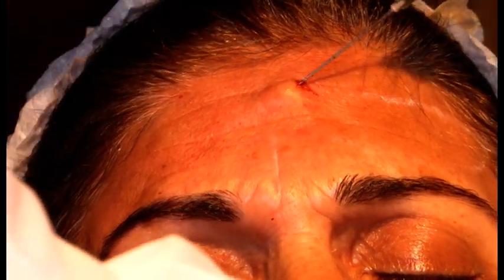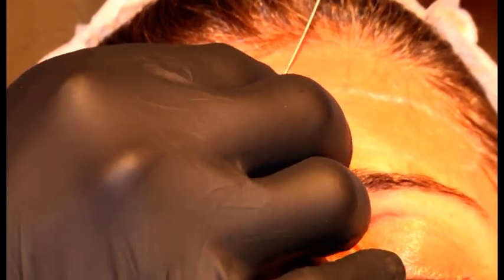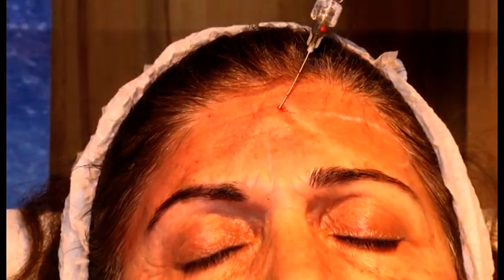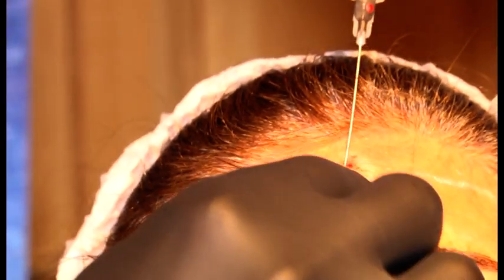And again, I take my time, right? Now, when I get to the midline, I start to inject even less, and I start to look at the markings on my syringe. And I also start to put a little bit of pressure on the supratrochlear arteries.